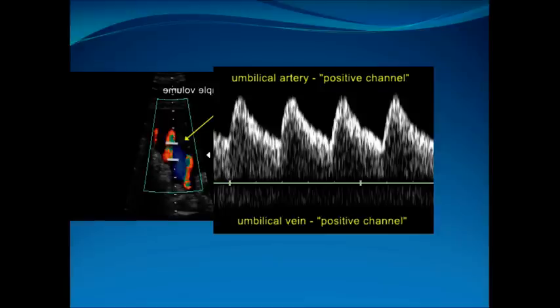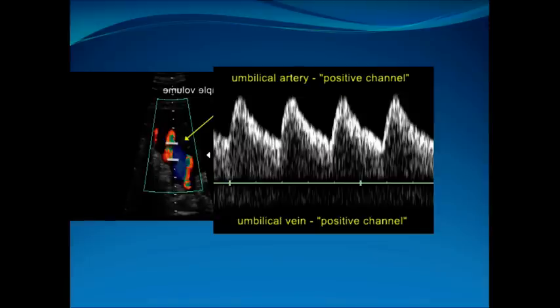When we sample, we wish to examine the umbilical artery. We place the colour flow over the cord and where there is turbulent flow — shown by the difference in colours, the greens and oranges — is where there is more turbulent flow. If we sample there, you are likely to very quickly get onto a vessel that is arterial. Do remember that in the cord you have both vein and artery, and it is the artery that you want to sample.